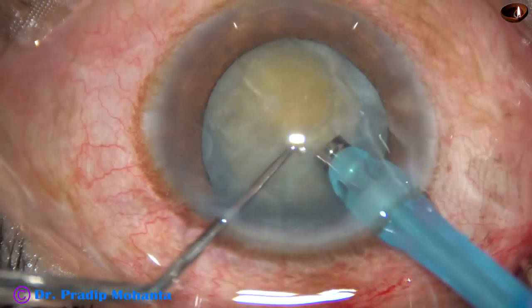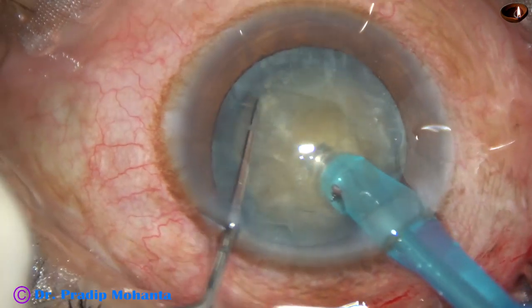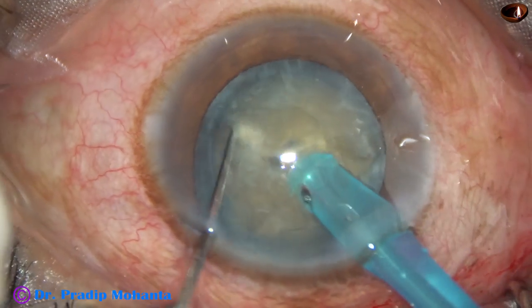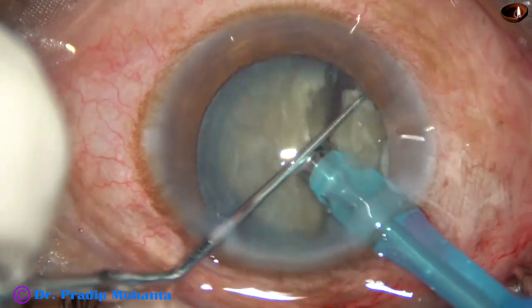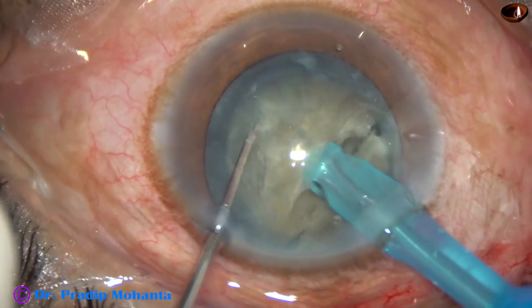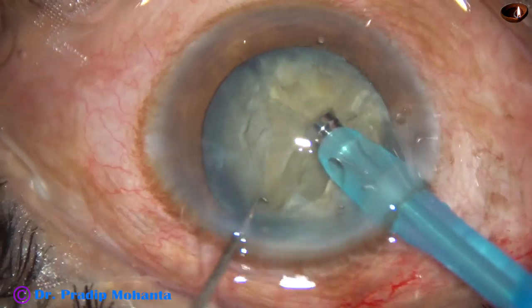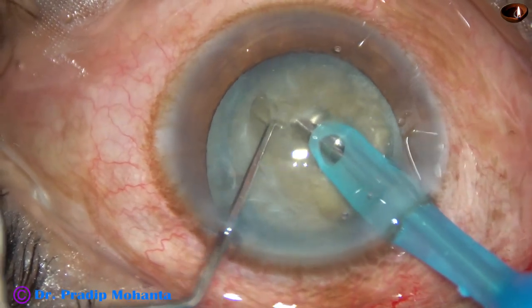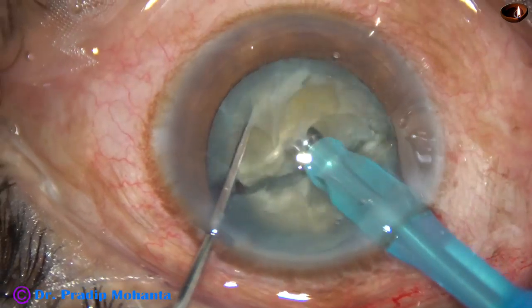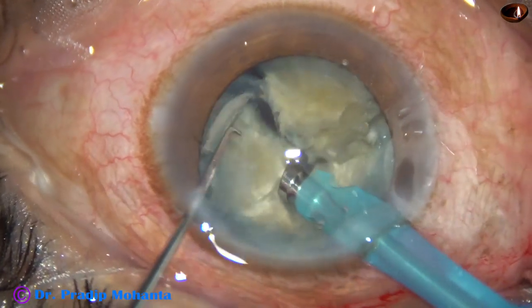Now here is what I call the submarine job. The tip goes into the substance of the nucleus, moves through the substance towards the opposite equator. And here it is — the nucleus is divided into two halves. Now each hemi-nucleus is subdivided into two parts, giving us four large elements.